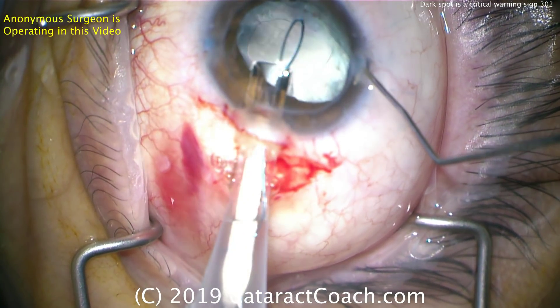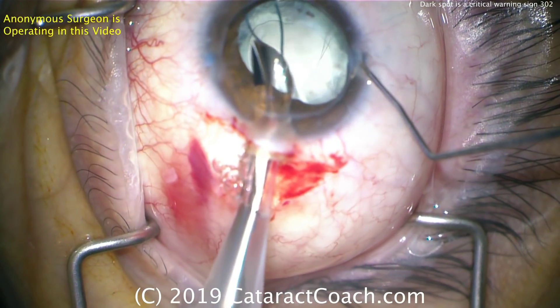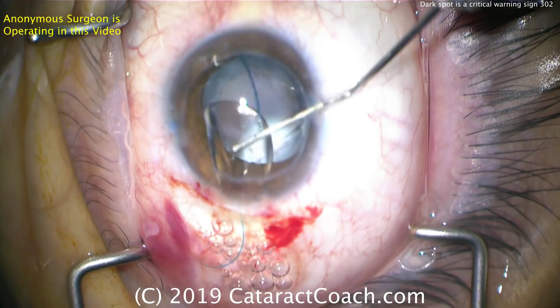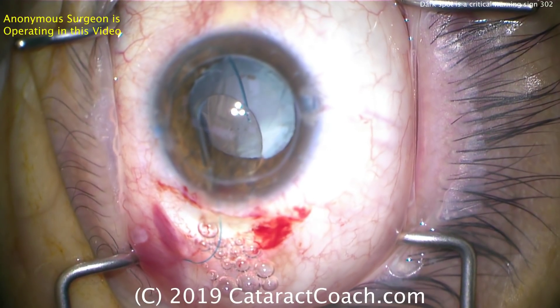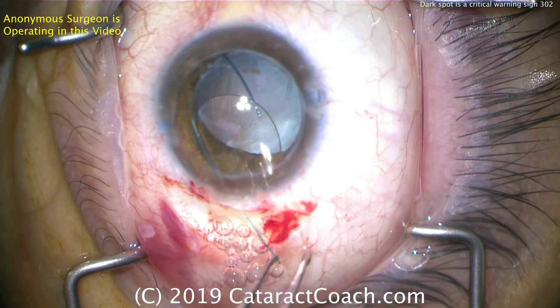Here comes the lens — looks like a three-piece acrylic lens being placed here in the anterior segment, and that'll in all likelihood be dialed into position. That trailing haptic needs to be flipped over. Remember the orientation: the leading haptic should look like a number seven, and the trailing one should look like the letter J — just like that.